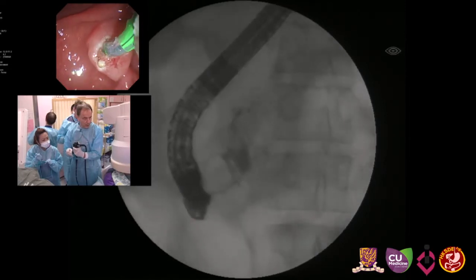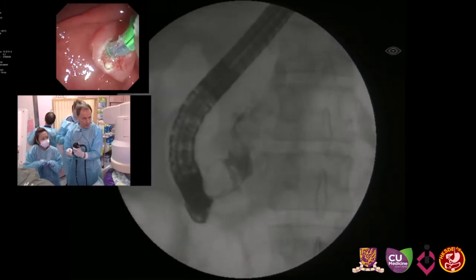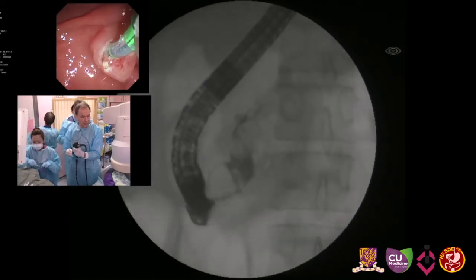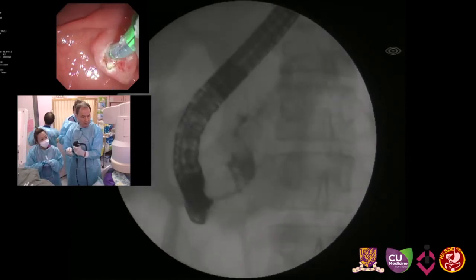Yeah, possibly. We can see the possible duct. You see the huge stone. Huge, yes. We see the dilated duct and above, alongside the spine, you see the dilated duct. So this actually is a complex stone and stricture.